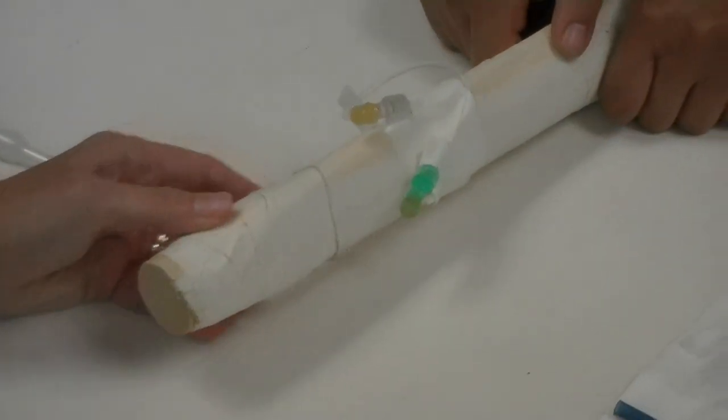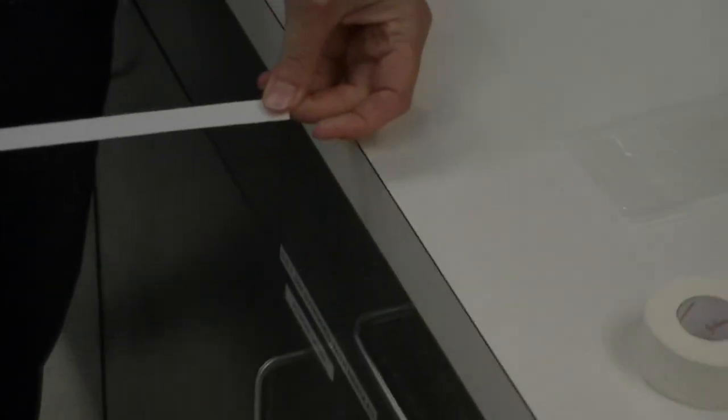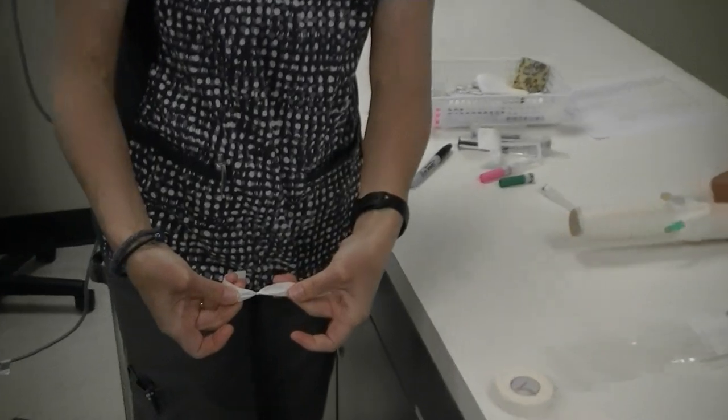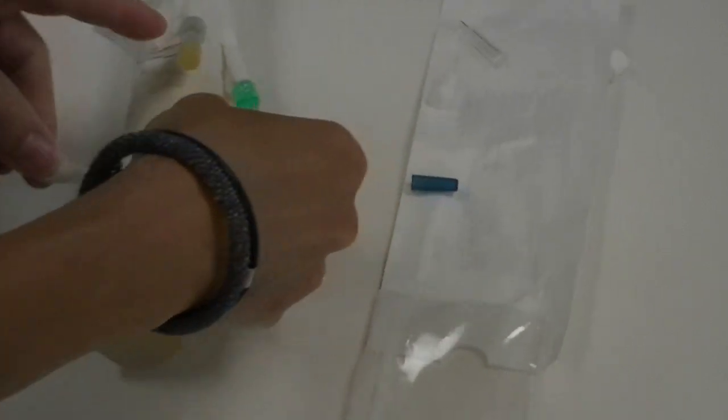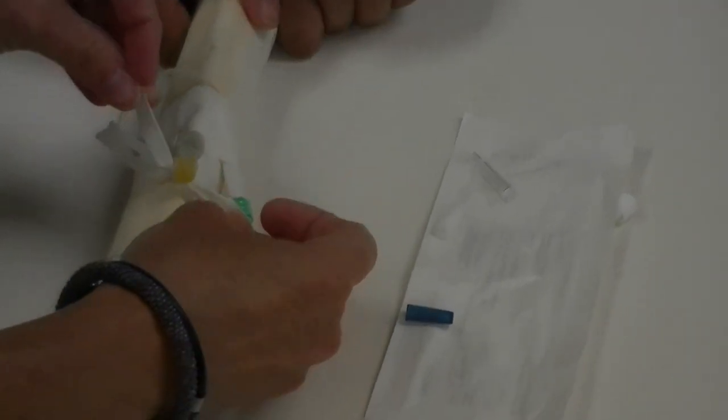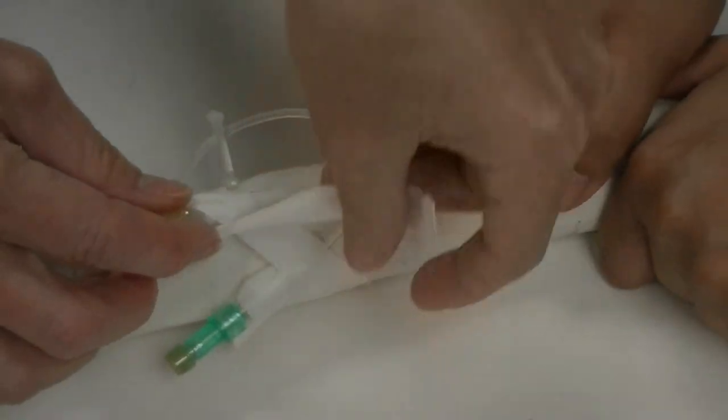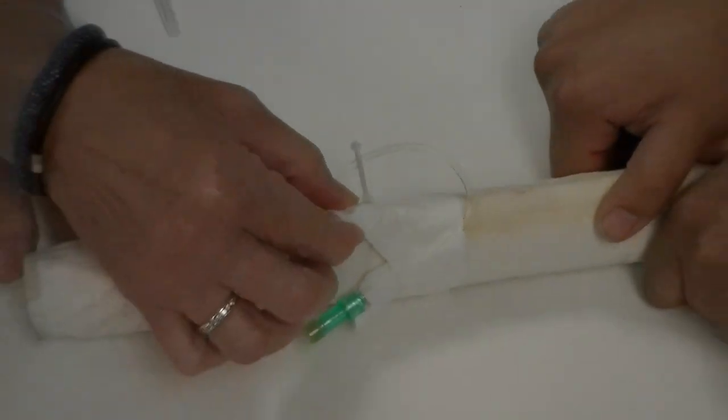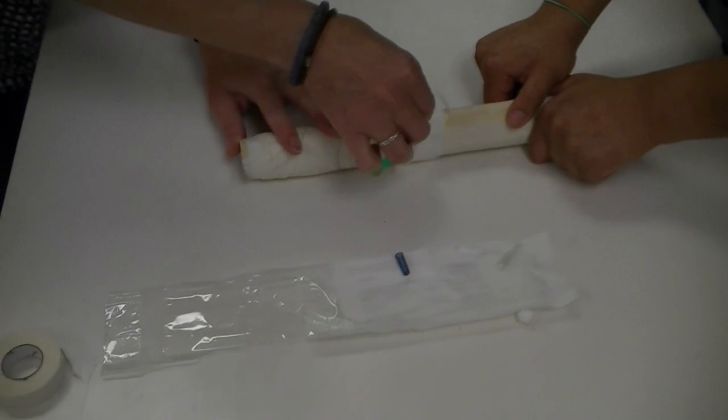And then one more portion that we do is what we like to call a bra or an anchor tape. It's half-inch tape, about four inches, twisted in the middle. Then I'll come up to the T-port portion, and I want to make sure that I have one piece of my anchor tape above this tee. I'll come across and then make an X across the other side. The anchor tape ensures that if there's a disconnection here at the connection hub, that back pressure is not going to disconnect everything, and the patient won't bleed out of their catheter.